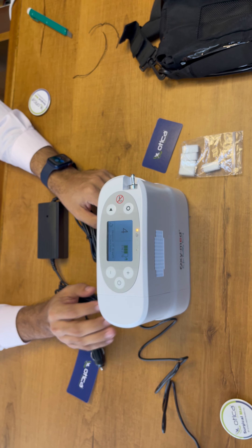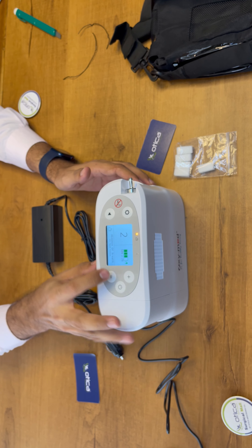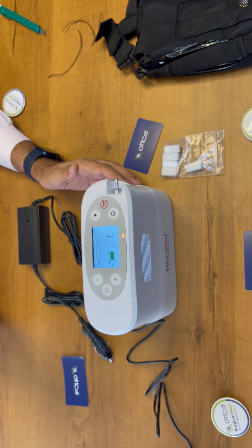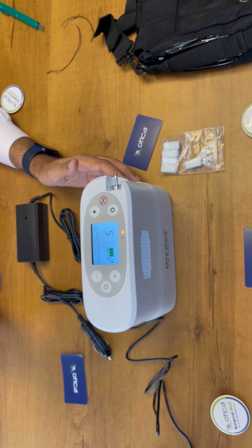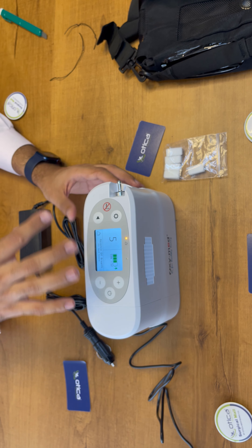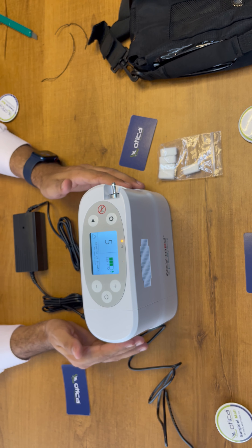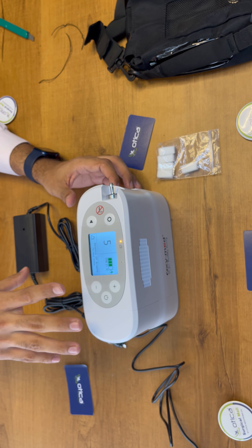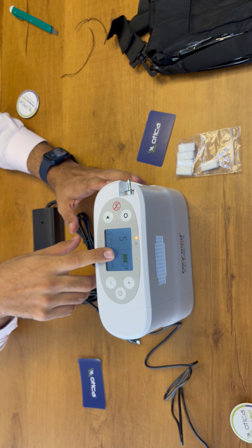Regarding battery life: when using the device at 1 liter per minute, the machine will give a battery backup of 4 hours. When you increase the flow rate — we have practically cross-verified it — at 5 liters per minute, the machine gives a battery backup of 2 hours. Battery conditions also depend on surrounding factors such as oxygen level in the room, humidity, air temperature, and various other parameters, but on average the machine gives 2 hours at 5 liters per minute.